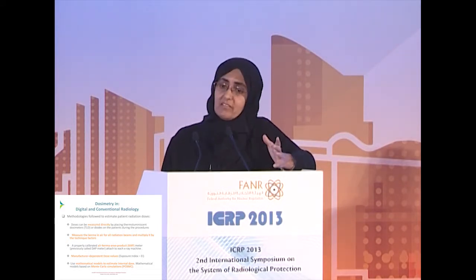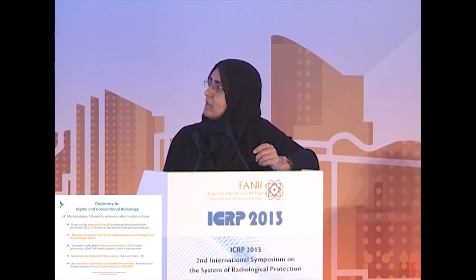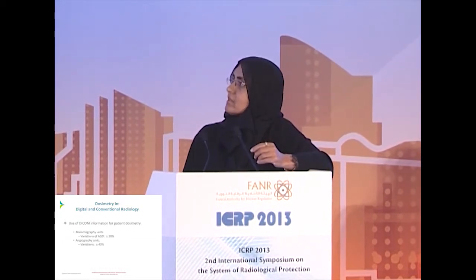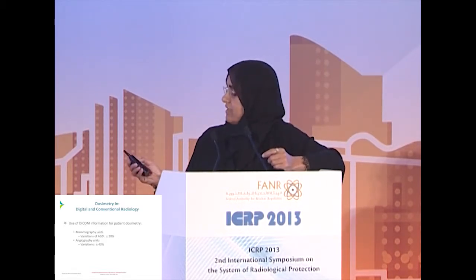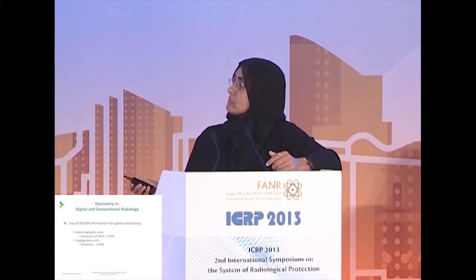There are manufacturer-dependent doses, although there is a large variation in this, and also mathematical methods such as Monte Carlo techniques. These are all methods used to evaluate the doses. We can also extract information from DICOM, and we get the dose values, but this shows a large variation, something like 20 to 40% in the examination.